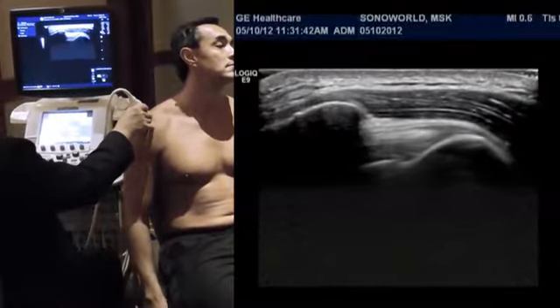The 3 units are the bone acoustic landmark of the greater tuberosity. The second unit is the fibrillar pattern of the supraspinatus tendon, which has a parrot beak contour. The third unit will be the subacromial subdeltoid bursa.